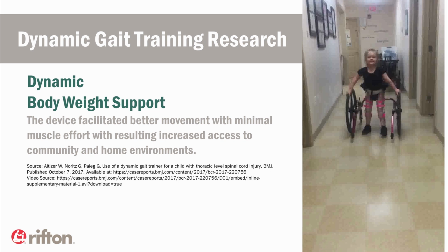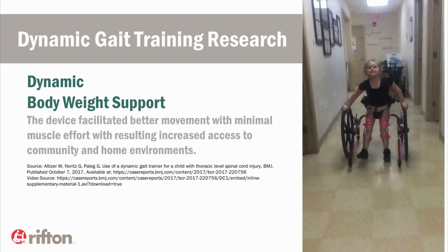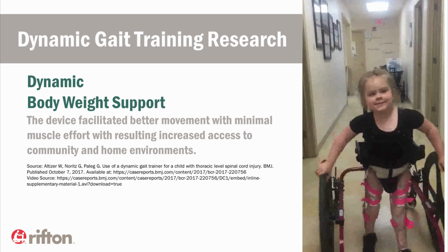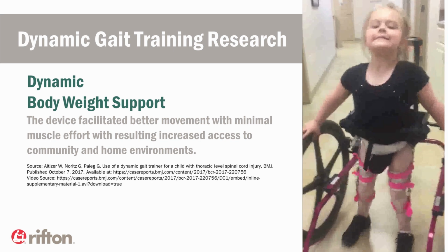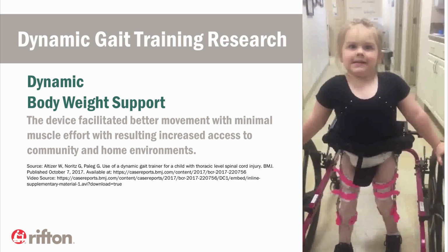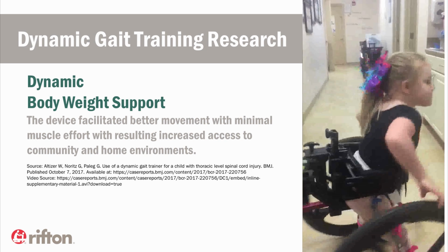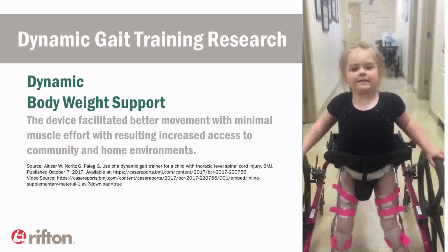So this gave her access to community activities, and even though her sensory motor recovery did not change below the lesion, just by virtue of the device, she was able to improve her activity and her participation.